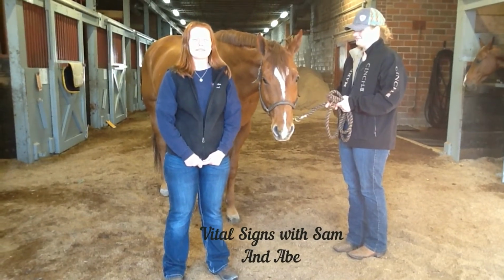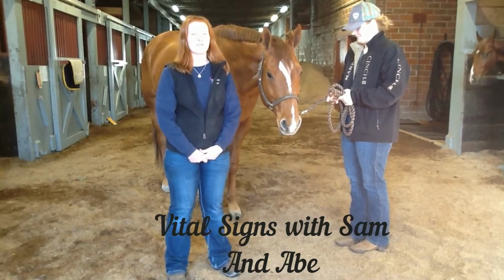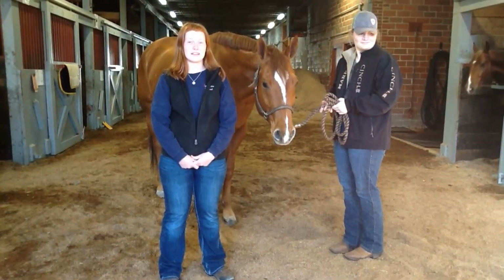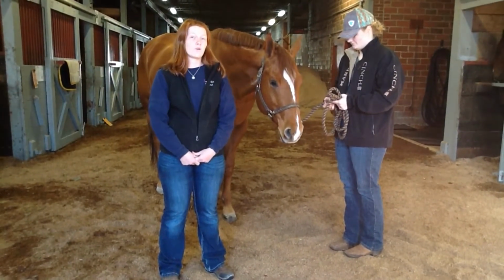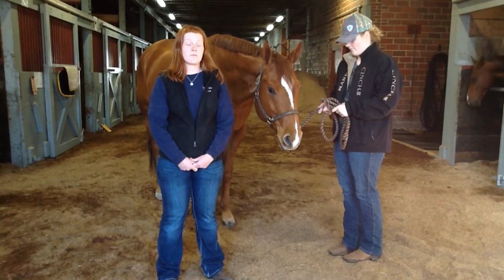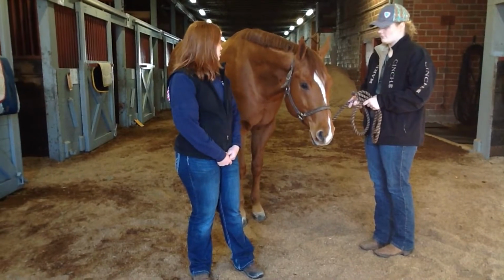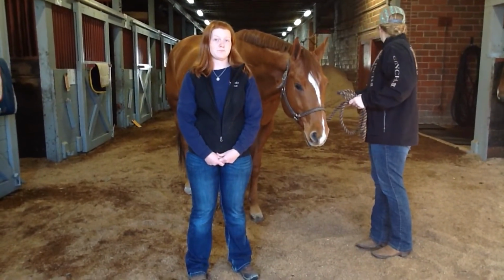Good afternoon. My name is Samantha Talbert, and this is my healthy handler, Abe. He's going to be our demonstrator today on how to take vital signs on your horse. Whenever you're taking vital signs on your horse, there are some things that you're going to want to check. These include the mucous membrane, the capillary refill, your skin pinch, respiratory, gut sounds, and temperature.